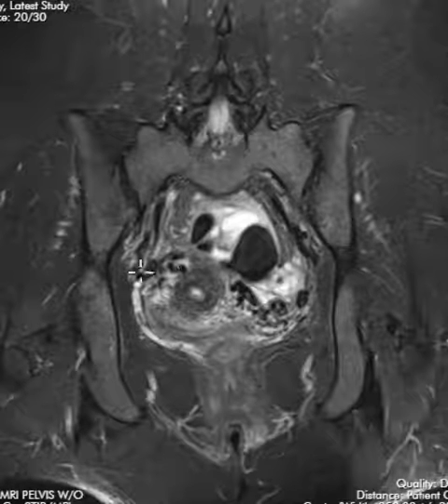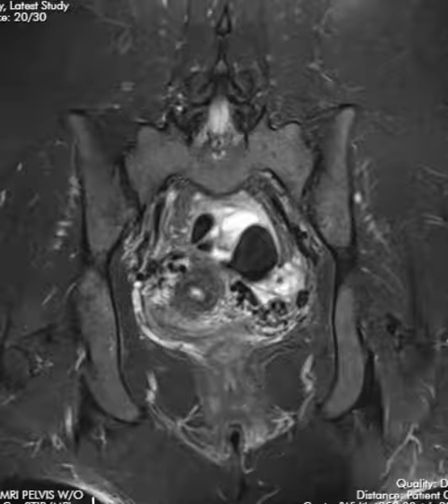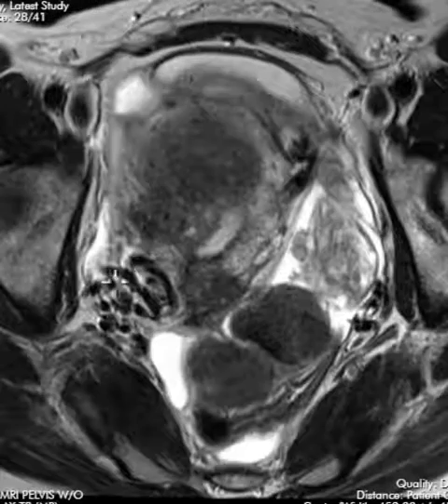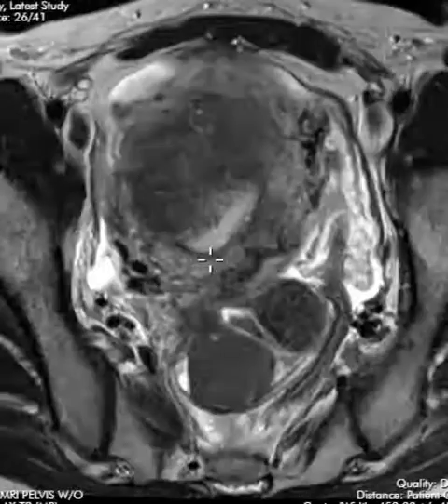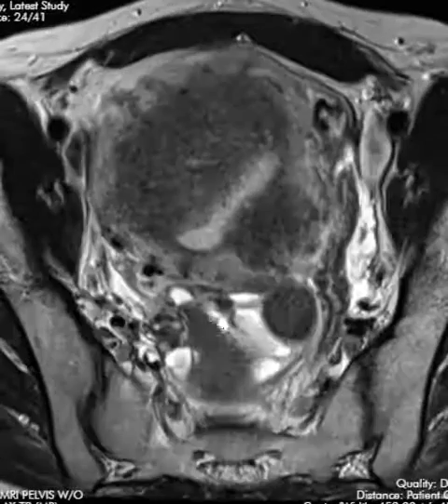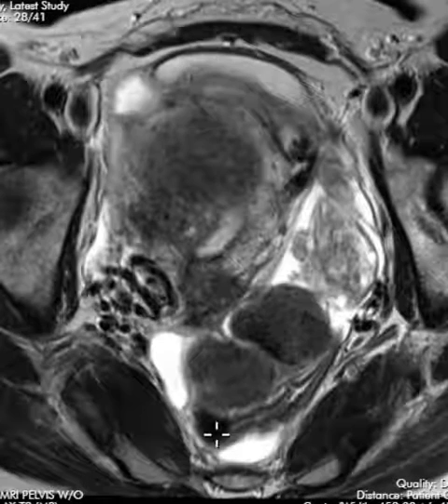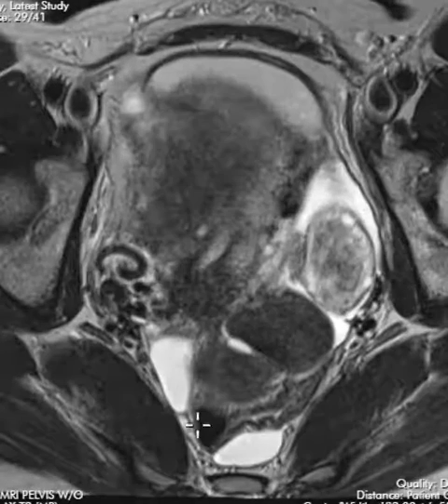This patient also had some distended pelvic veins, which could go along with pelvic congestion syndrome. You can also see them on the axial sequence, especially on the right side where they show up pretty well. So this is again a case of adenomyosis — a really prominent diffuse form — associated with other manifestations of endometriosis, including these endometriomas and fluid. Thank you very much.